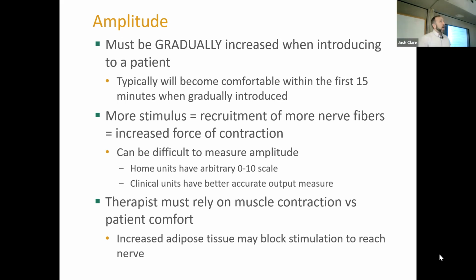We want as much stimulus as a patient can withstand while producing a quality contraction. Once we see a quality contraction, we see all of the fibers are contracting, we don't need it up anymore. How many of us in here do a good job with these electrical currents, and don't get bothered by it? I know we have some people that hate even the idea of it. So you guys, we might ratchet this thing all the way up, and just because we're on the perfect motor point, we have decreased impedance, you might feel like, no, I feel the contraction. It doesn't bother me though.